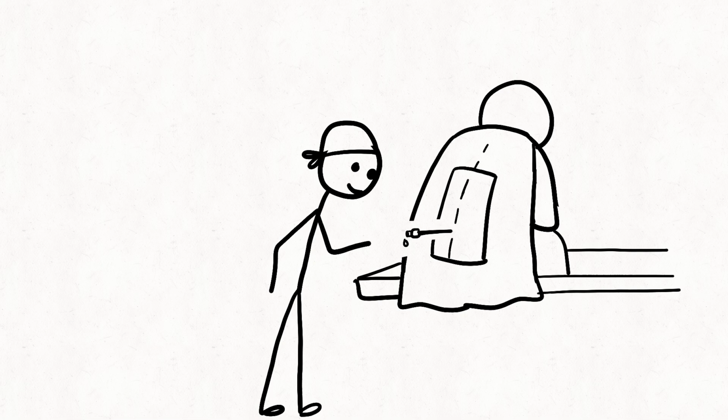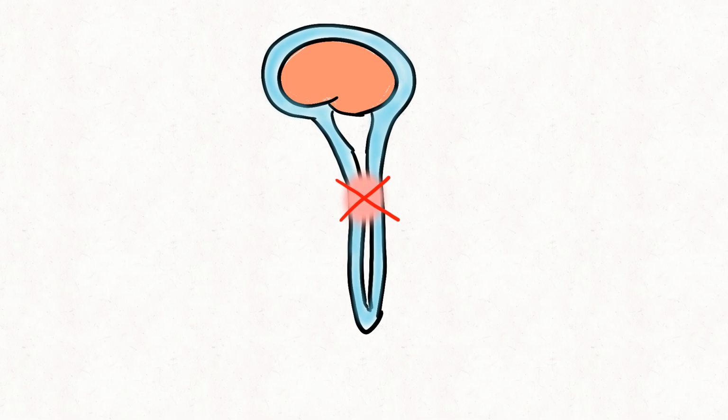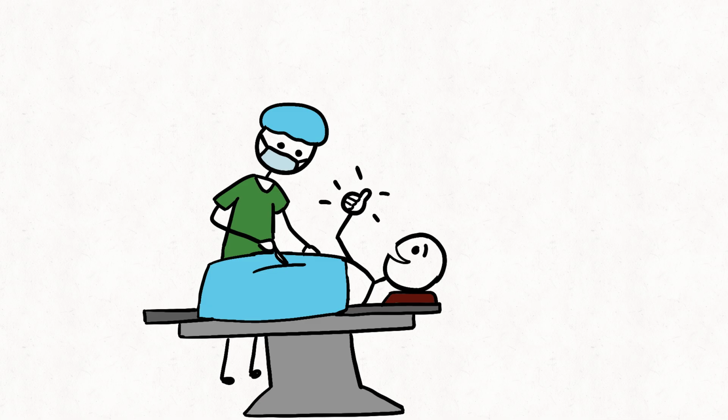When clear CSF appears, it confirms correct placement. The anesthetic drug is finally injected slowly into the CSF. The local anesthetic blocks the nerve conduction. Pain signals from the lower body cannot reach the brain, so the patient remains awake but feels no pain.